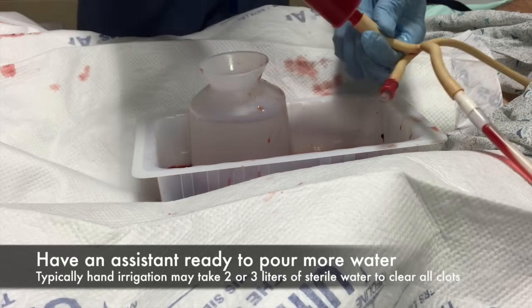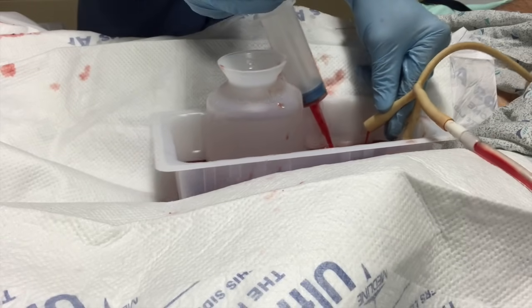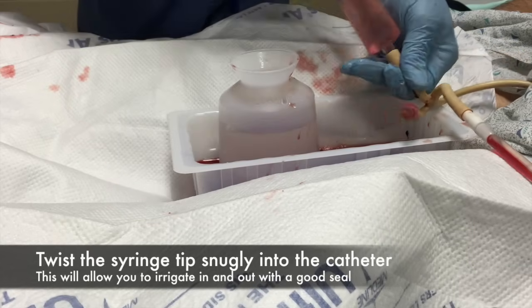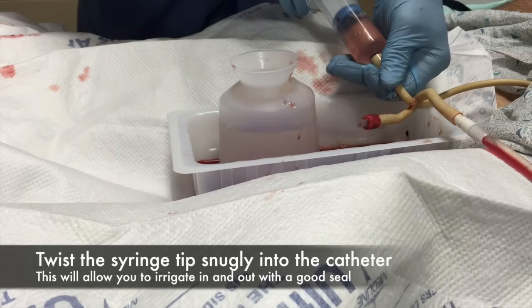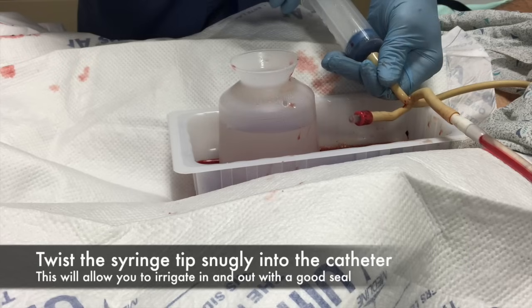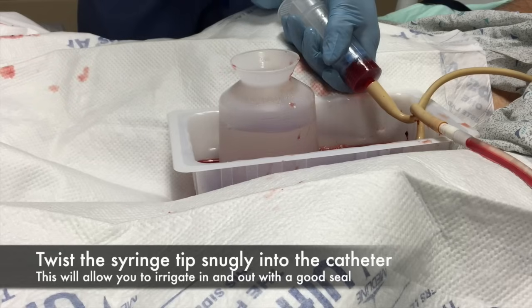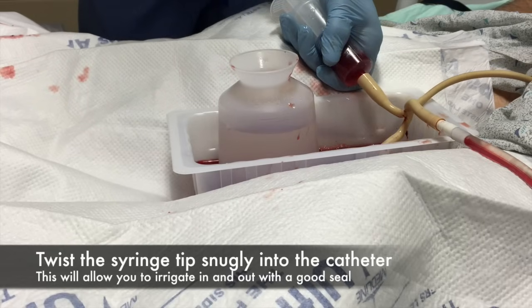One word of advice is if you're a righty and you irrigate right-handed, you should have the patient scooched to the side of the bed closest to you so you don't have to lean over and hurt your back. You should be on the patient's right side if you're right-handed and on the patient's left if you're a lefty.